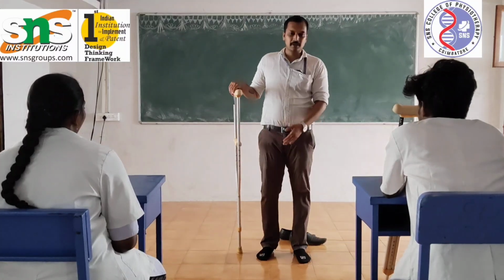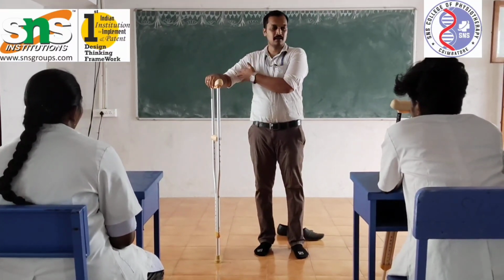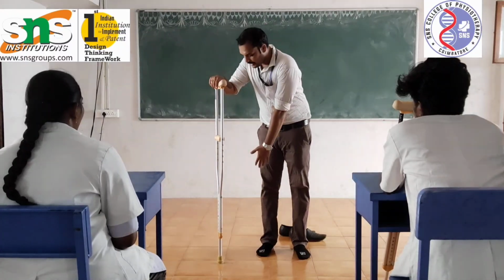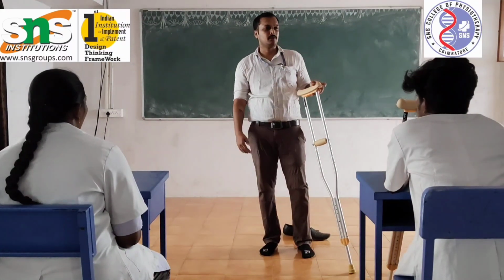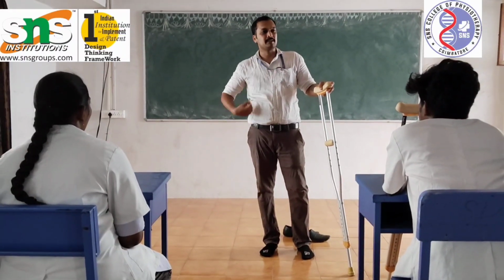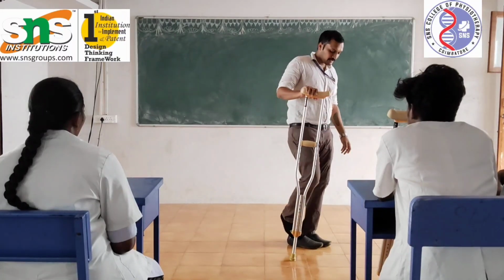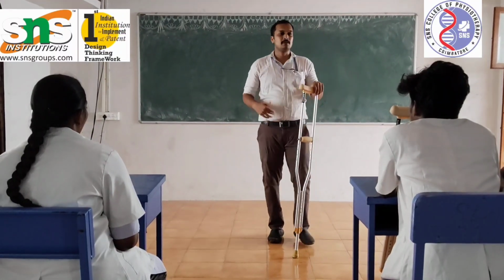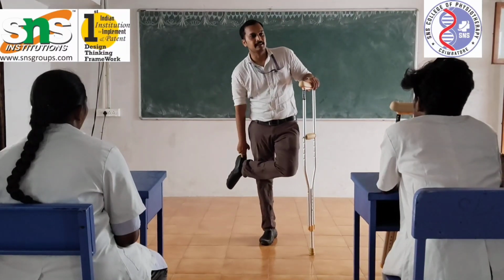So for shoes off, we have to measure from 5 centimeters below the axilla downwards, in a straight line directly to the foot, with the help of an inch-tape. We can measure directly. If we are going with shoes on, what will happen to our body height? The height will slightly increase.